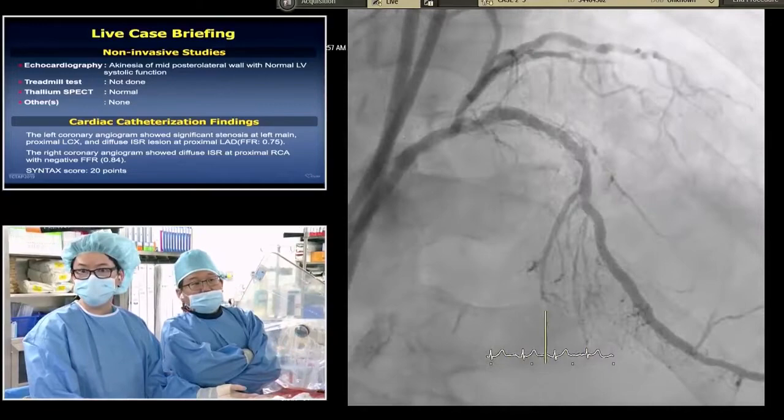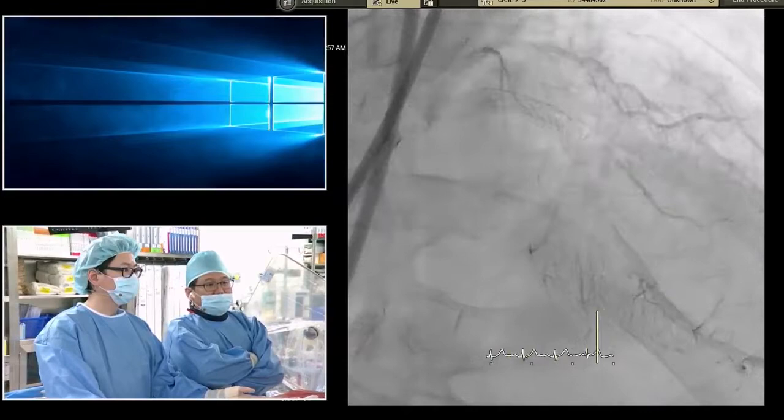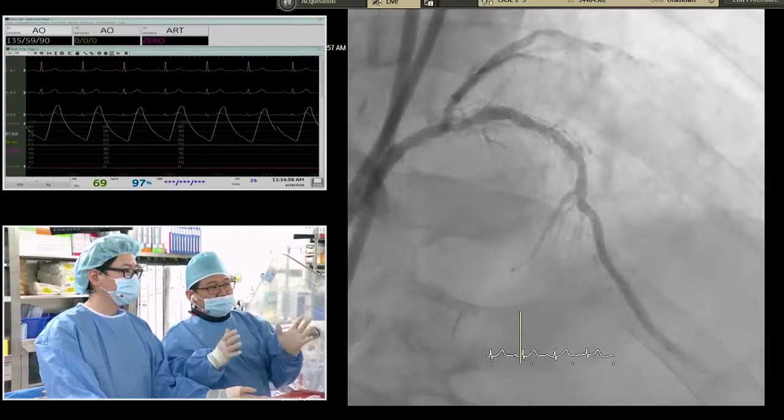We evaluated the RCA previously, so we measured FFR. RCA FFR is 0.84. There is some diffuse neointimal hyperplasia, but FFR is 0.84, so we don't need to touch the RCA. Okay, we just focus on the left main bifurcation.